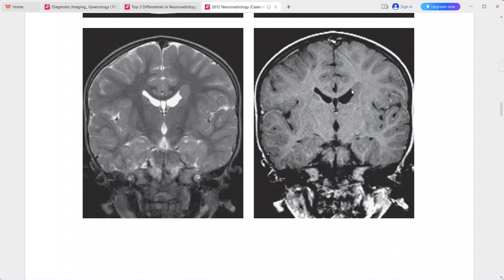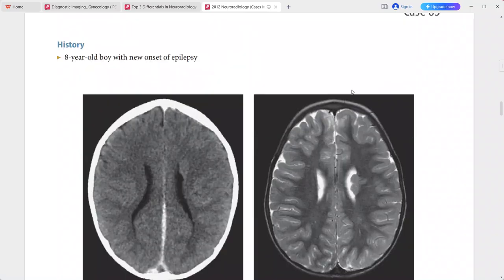These imaging features are typical for grey matter heterotopia. Differentials include subependymal nodules of tuberous sclerosis and normal body and tail of the caudate nucleus.